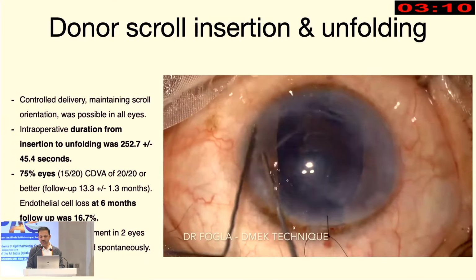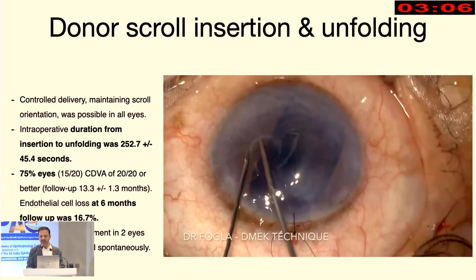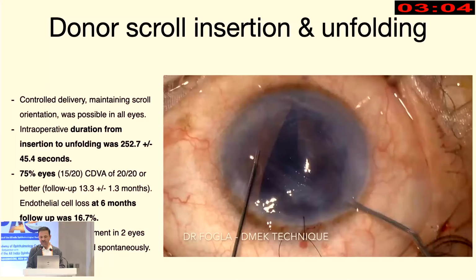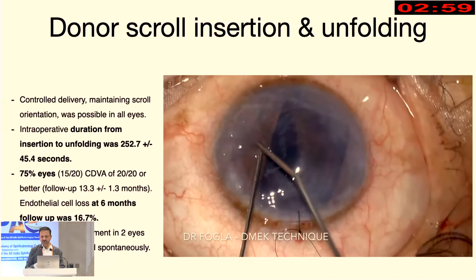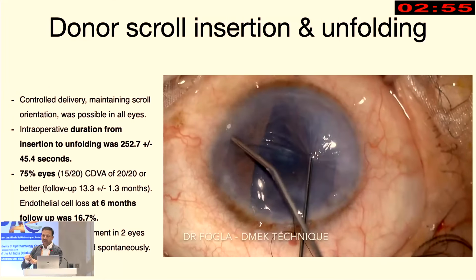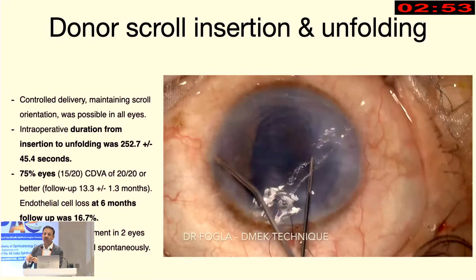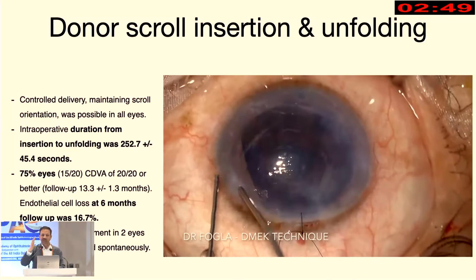Once this is open, you can tap on one side to move the graft, and then again release a little bit of fluid so that it doesn't come back. And this is again very important. Once your tissue reaches the desired position, the lifting of the cannula should be very slow. If you lift it too quickly, the movement of the fluid column will again bring the graft back.